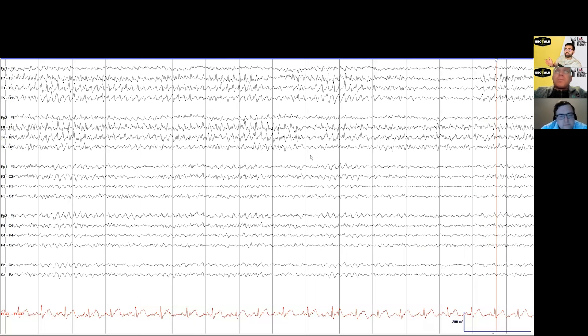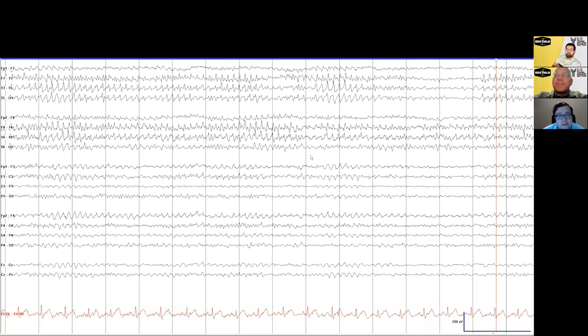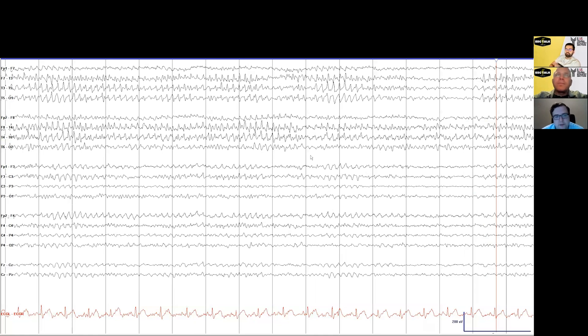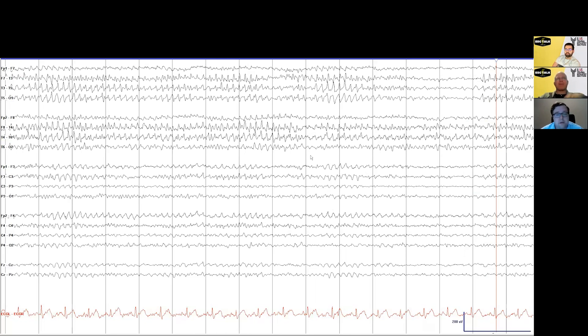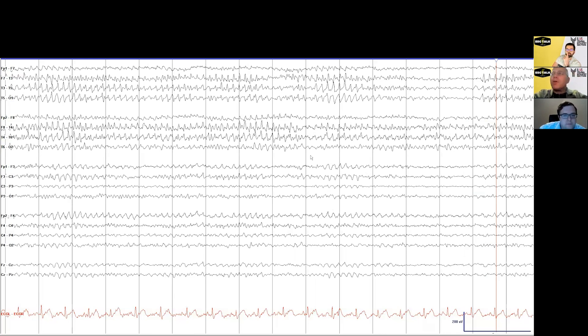But at least it increases the risk, right? And I'm not going to call it in a normal study though. That was the original concern, but it seems at this point that there's no longer any sort of correlation between epilepsy and RMTD. It's seen in about, depending which study you look at, up to two percent of the population, normal included. It should be usually bilateral or bilateral independent. If you do have a study where it's always on one side, just like with lots of normal variants, that could be pathologic.